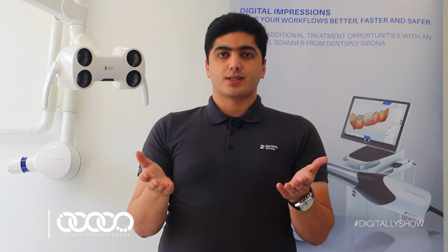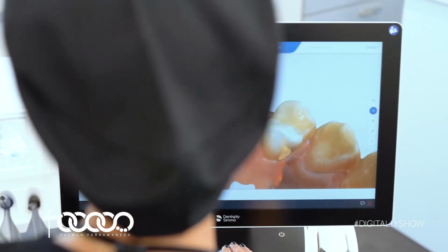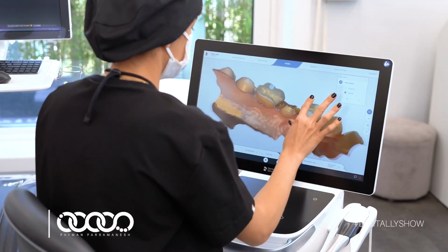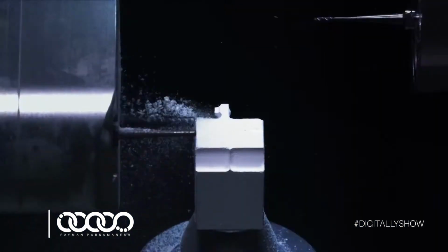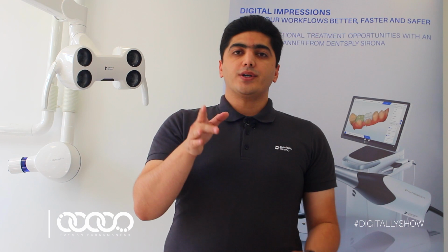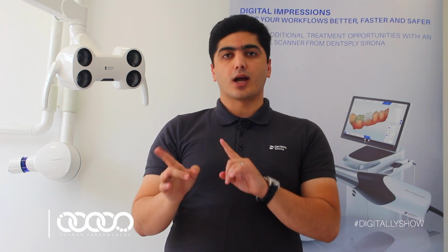So what's the difference? When you select digital impression, you should know that you are going to outsource the rest of the workflow to, for example, a laboratory. But when you select single visit dentistry, you are going to do all the workflow by yourself. First, I'm going to talk about digital impression or DI.